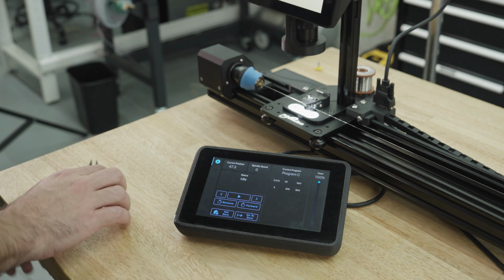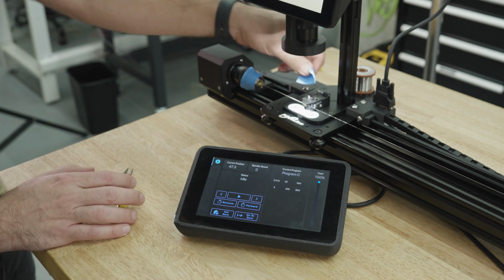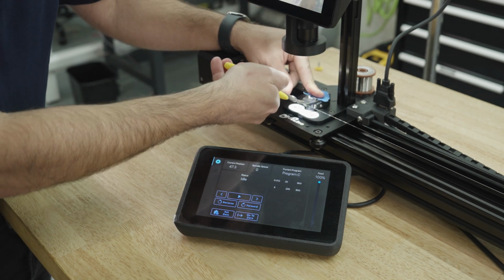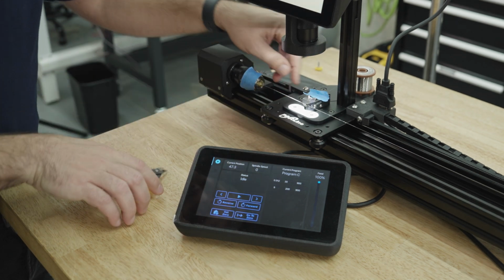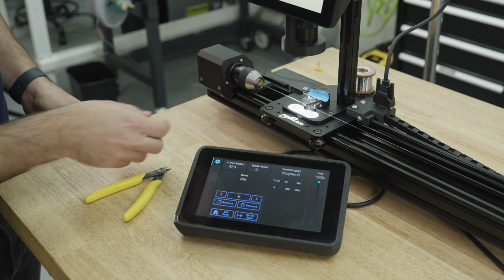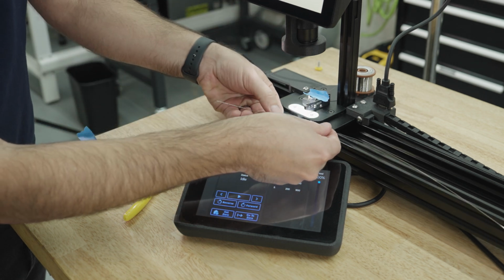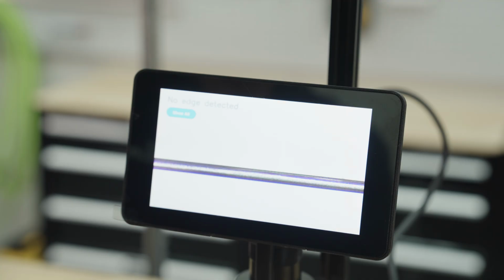To remove a coil, first tape the wire, then cut the wire. The mandrel can be removed and the coil slid out. Now let's take a look at the finished coil.